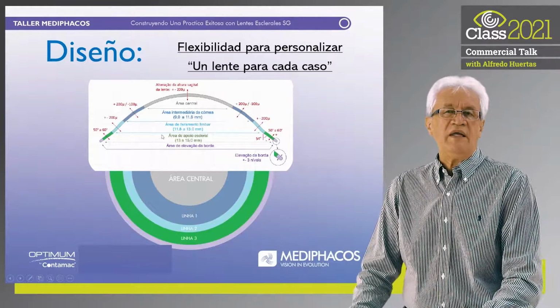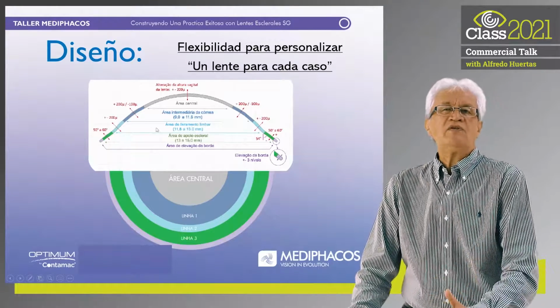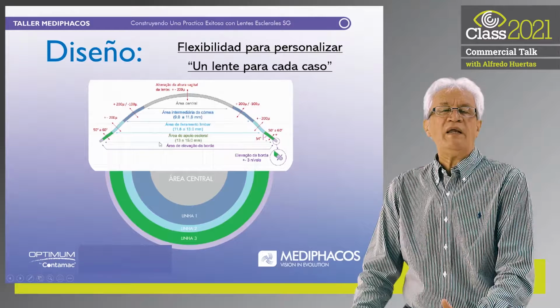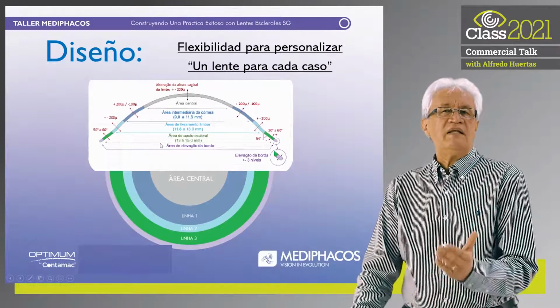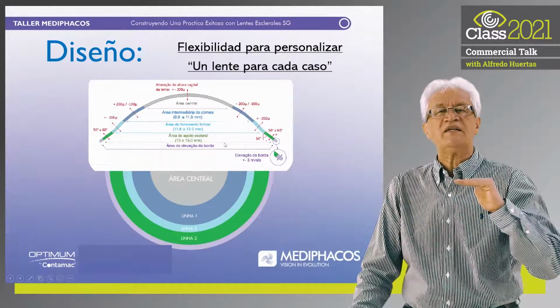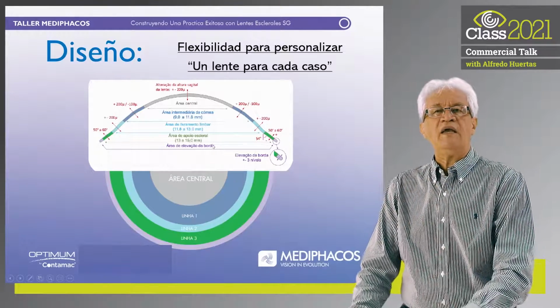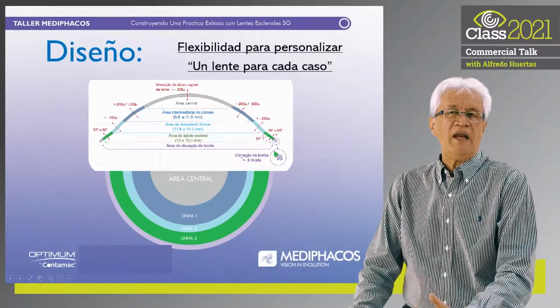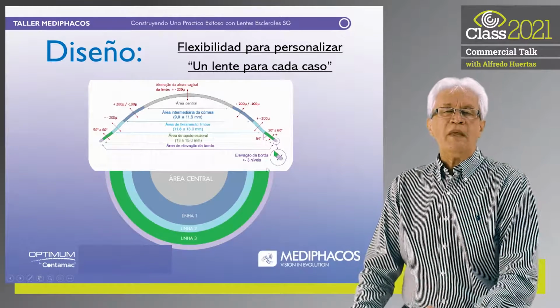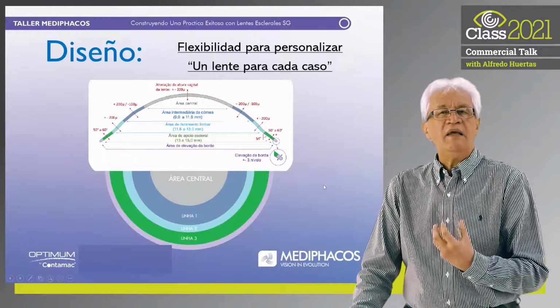There is something very innovative about the lens, and it is the scleral support. I can do it by calculating the support angle. Studies have shown that the landing of the lens in the sclera must be smooth, parallel, with an excellent edge, which can be calculated from -3 to +3. You will be able to observe with a good slit lamp, as the lens can be customized.